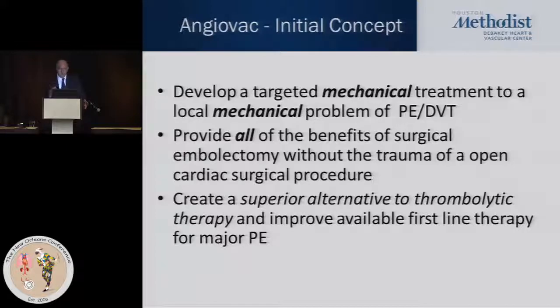So the initial concept of the AngioVac was developed by Lishan Acklog, the primary author of that paper. Lishan got together with Brian de Guzman and a few others, and they brainstormed and came up with a concept to develop a minimally invasive targeted mechanical treatment to a local mechanical problem of pulmonary embolism. This was the driving force, and it's a little ironic, and you'll see why later on, but the driving force was to treat PE.